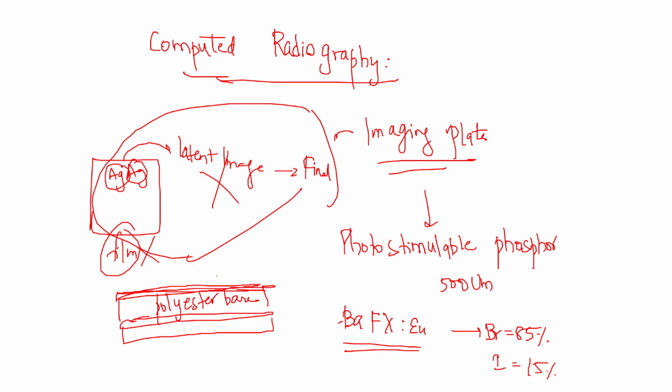Now, what actually happens is that X-ray photons are projected onto the photostimulable phosphor.